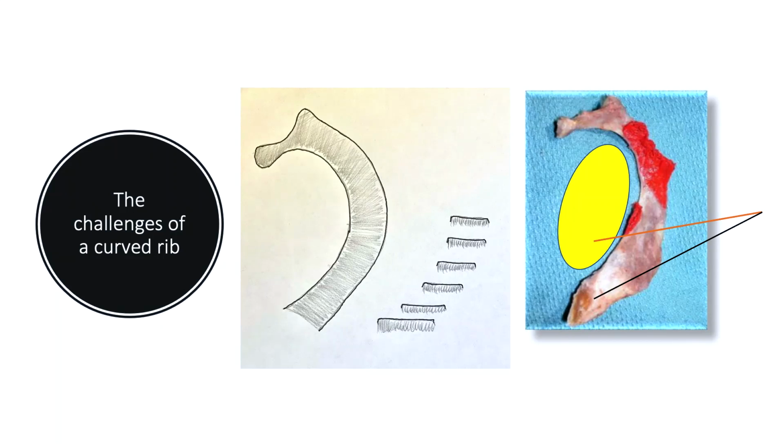So obviously, the easiest solution for that problem would be to always have visual contact with the needle. But we all know that that's not possible. The needle appears, and we kind of throw a party for it, and then the needle disappears for a whole 20 seconds.